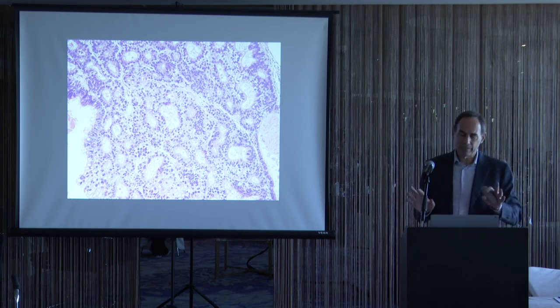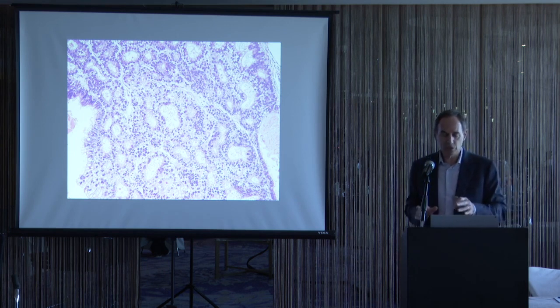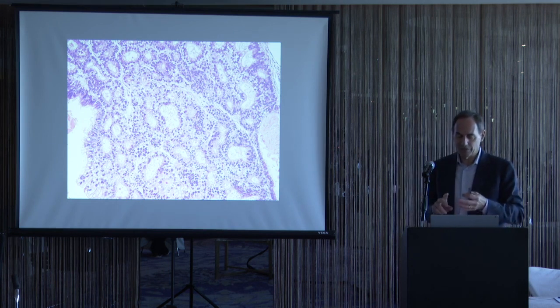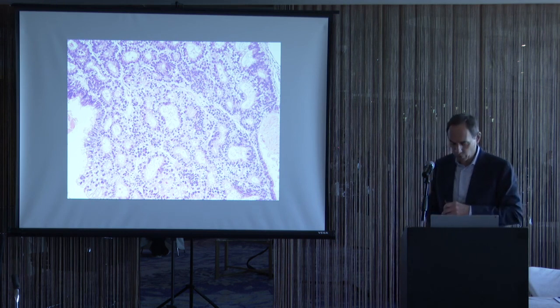With seminomas, embryonal carcinomas, and choriocarcinomas, most are relatively similar one to another. Yolk sac tumor has hepatoid patterns, glandular patterns, polyvesicular vitelline patterns, microcystic patterns, etc. One of the patterns is the enteric or glandular pattern, where you have multiple tubules.